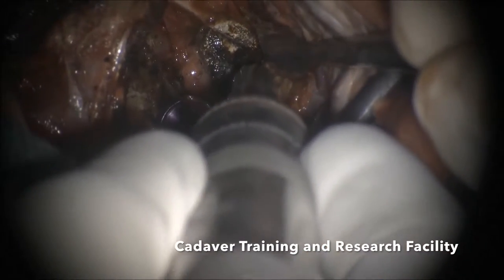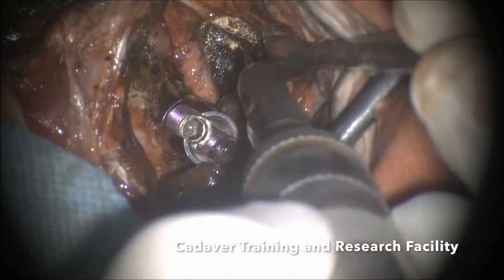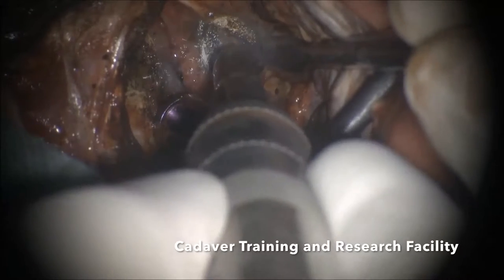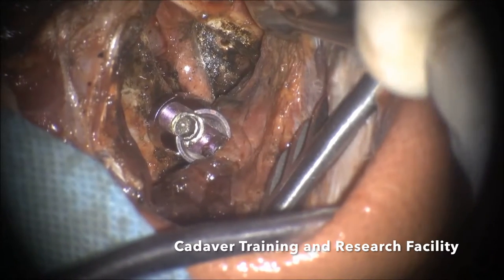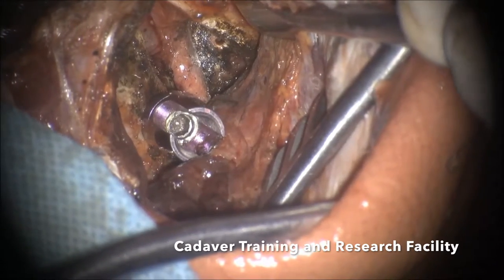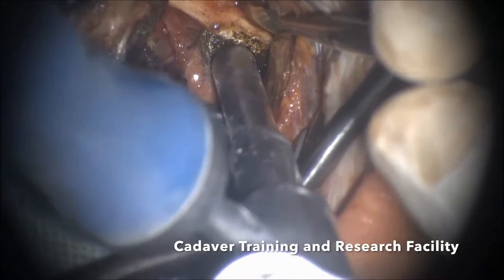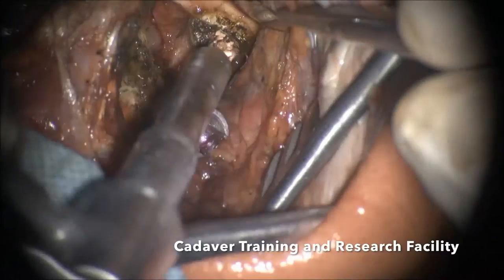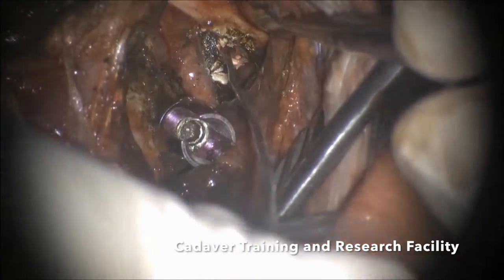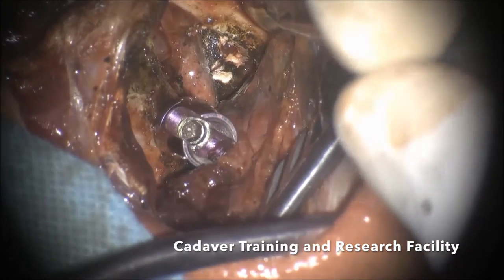This is the lateral part, this is the medial part, this is the midline — maybe 2 degrees laterally. Venous bleeding has been overrated — if you follow these principles it does not bleed at all. You should always feel with the sound so that you know you are not going through any important structure. Now, can I have an 18 millimeter screw?